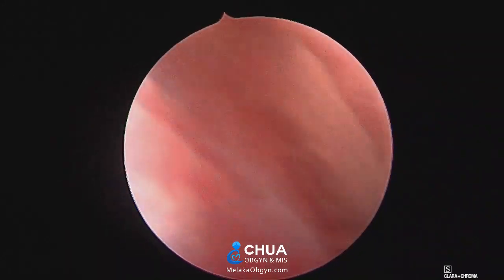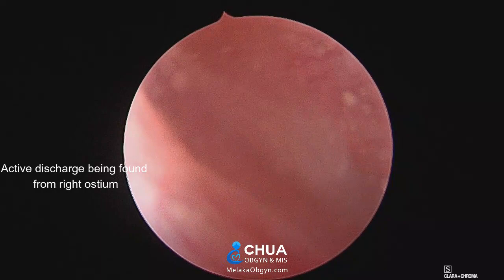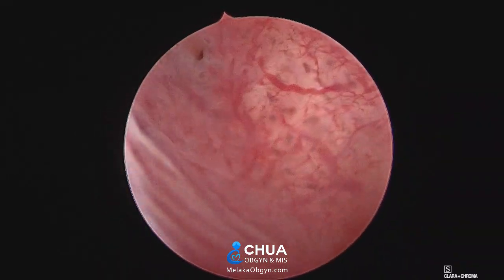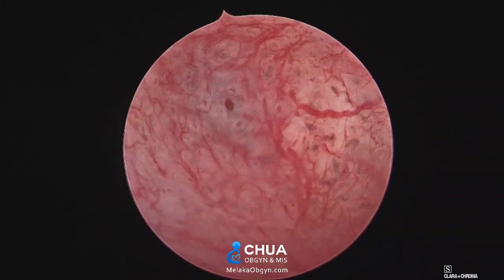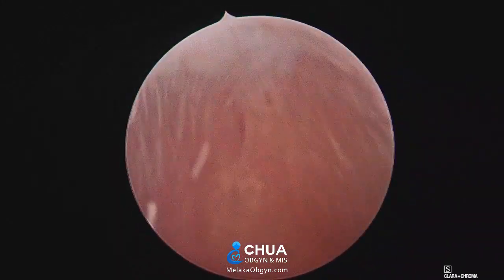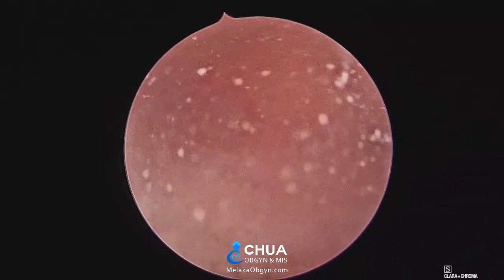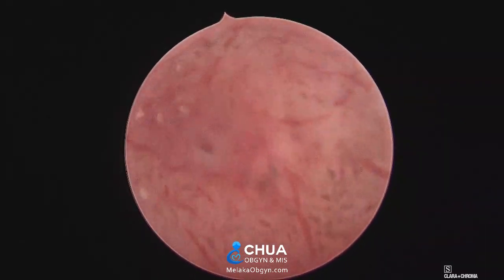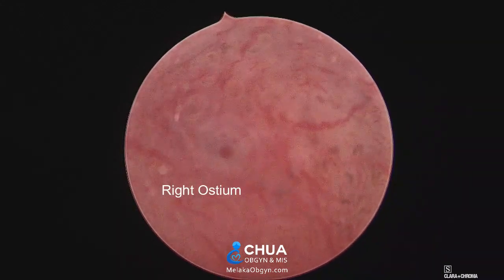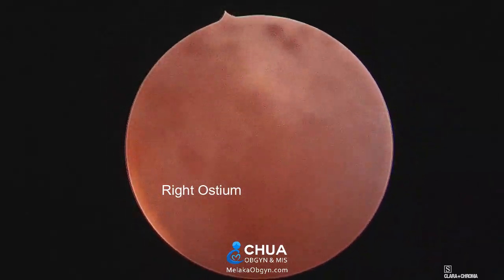You can see the active discharge — which is blood and pus — being seen discharging from the right ostium. This is a rather classical sign: if you have a tubal ovarian abscess and you relieve the uterine pressure during hysteroscopy by releasing the hydrostatic distension, you will see the pus coming up from one end of the fallopian tube, just like this.